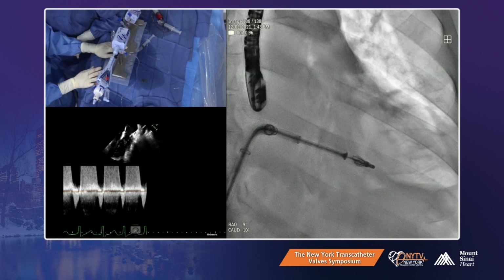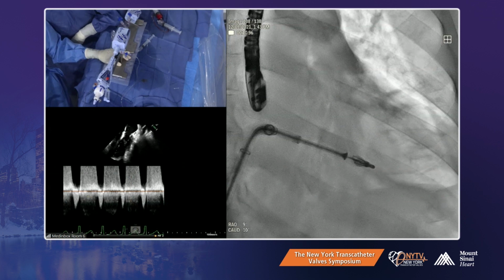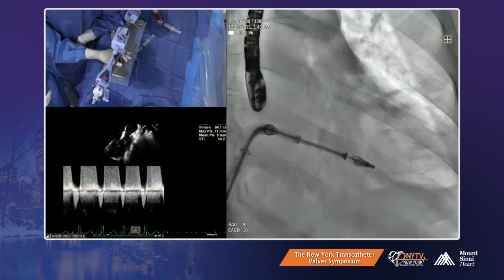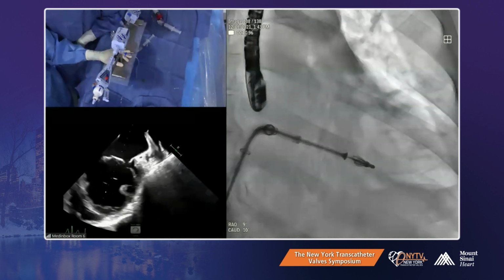Yeah. Look, ultimately, I think that's a pretty good position for the first clip. Offline, I'm not very impressed by the MR change. Yeah, we'll put a second clip for sure, but let's look at the color. I'm getting a mean gradient of 5, so let's look at the.